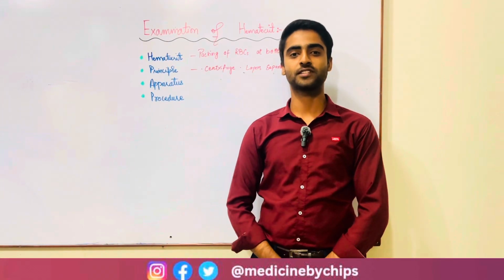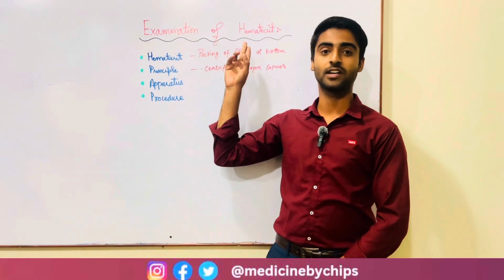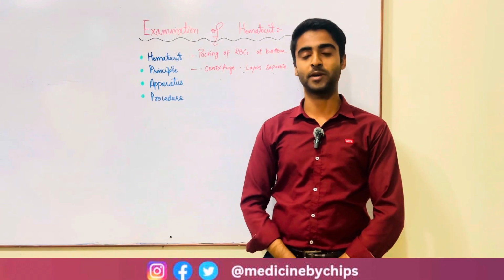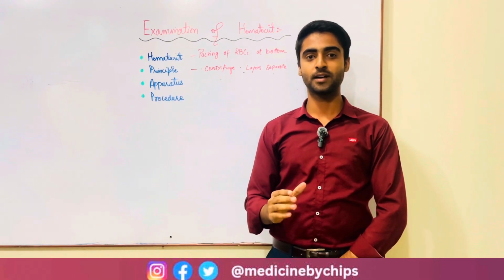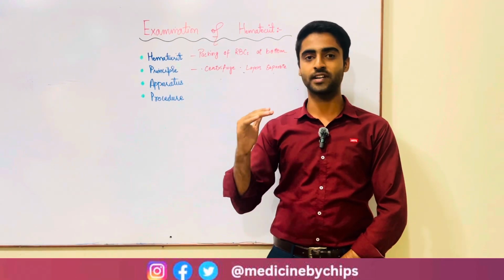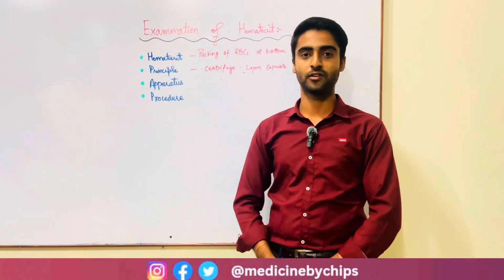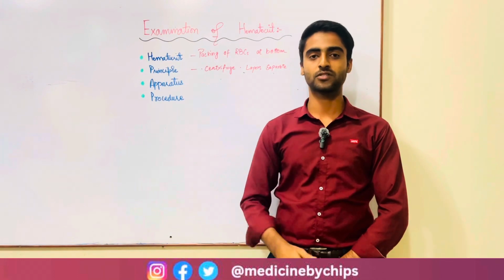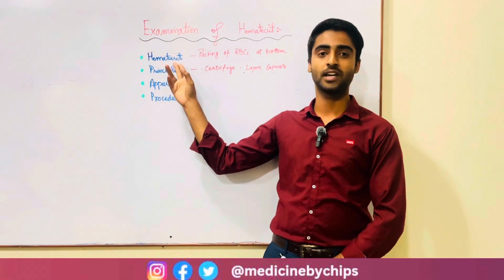Today, our topic of discussion is examination of the hematocrit value. First of all, you should know what a hematocrit is. Hematocrit is basically the packing of the red blood cells which settle down during the process of centrifugation. This is known as the hematocrit.